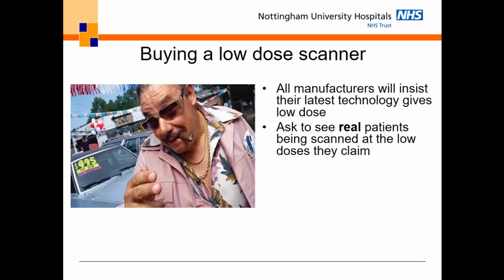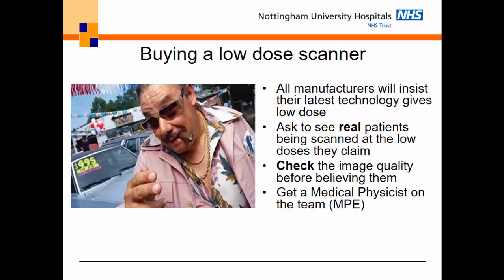They tend to be in the 90s, osteoporotic, been on a diet for the last 20 years or whatever it is, right? So you want to see the people that are in the waiting room, you want to see them scanned on the scanner, you want to see the dose that they got, and you want to see the quality that the scanner produced. So check the image quality before believing them. Don't just say, oh, it was a successful scan, see it.